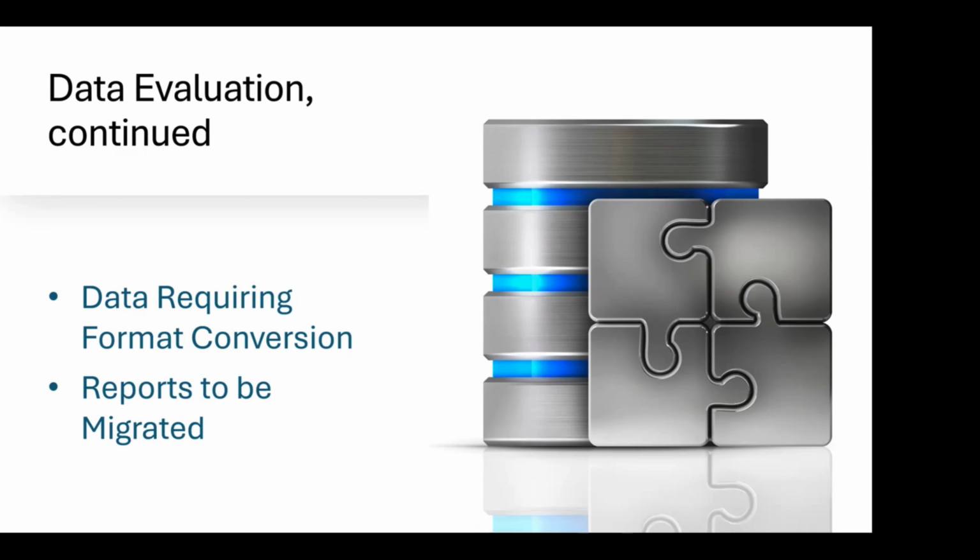Typically, they can be extracted from the database. In some cases you have to go and grab these things and then find out how you get the patient and accession identifiers. If you're going to rely on the DICOM SR format to bring over, it is highly recommended that you really look at those, because there's a couple different profiles that can be used, and ensure that's supported by the new system. I've seen organizations who check the box, we're going to use DICOM structure report, but they were stored in enhanced, and the new system only supported basic, so there was some work to be done.